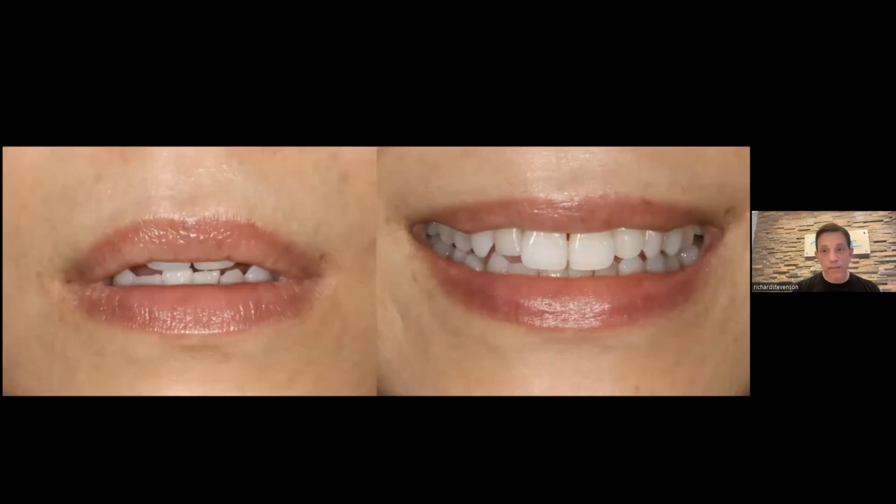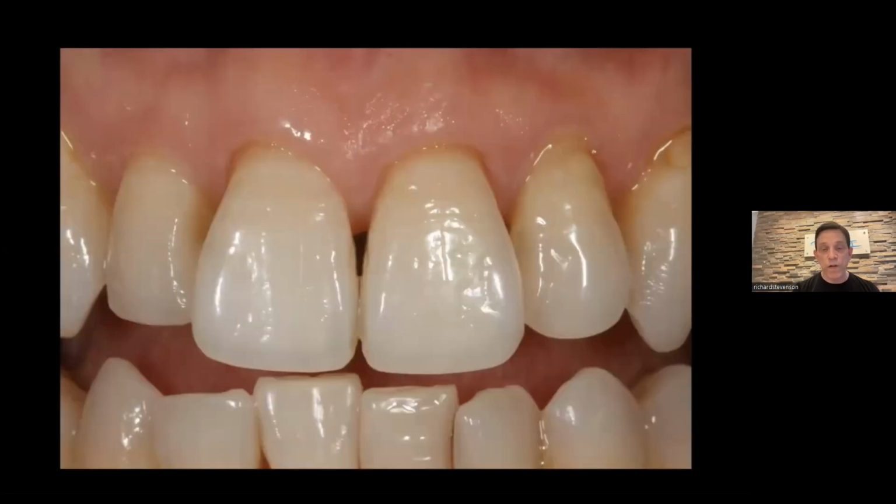Here's one of the ones I really like to share, because this is a case that I took to Beverly Hills. I took the patient with me, and I had her spend about 2 hours with Michel Magnier, Pascal Magnier's brother, who's a master ceramist. And he took probably hundreds and hundreds of pictures. And then we talked about how can we solve this issue of black triangles, right? If you look at the teeth themselves, they're really beautiful. They're nice shape, they're long, they've got a lot of texture. I think they look fantastic.